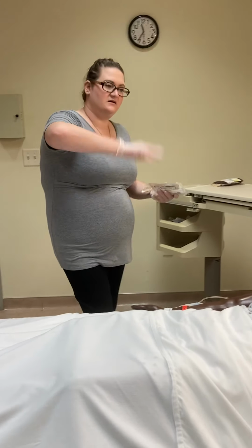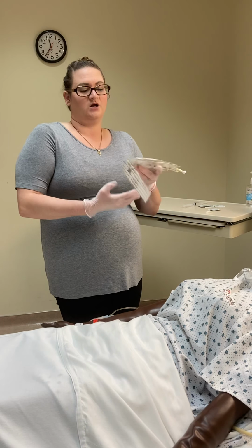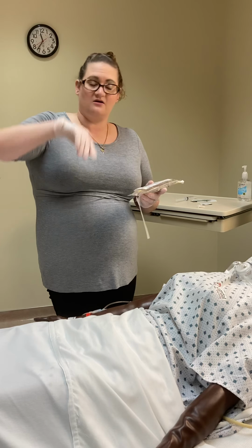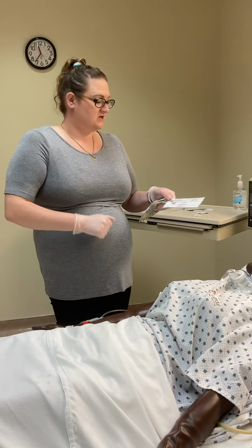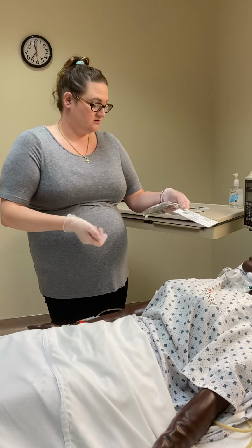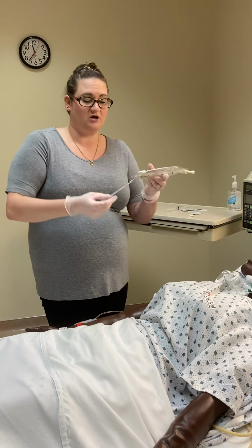So I'm going to get my second nurse to come with me, my second RN, and we're going to go in the room together. We've already looked at labs and everything outside of the room, but now we're going to go into Ms. Johnson and we're going to do all of these identifiers. A lot of facilities now have the scanning process. So you would scan for the patient's name and date of birth, and then you would pull up your blood administration record and scan your bag of blood, and it would populate your information. But you're still going to do a verbal confirmation.